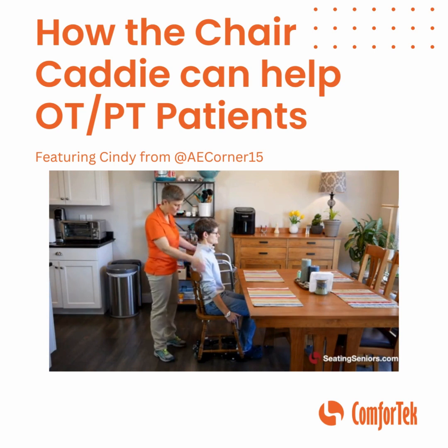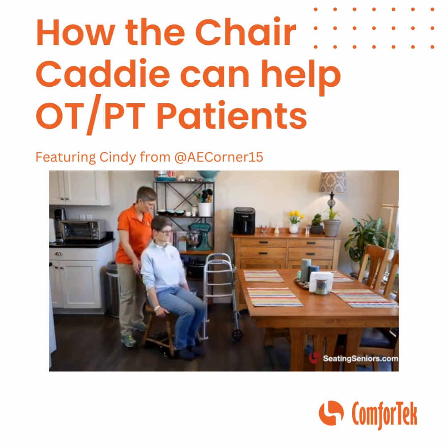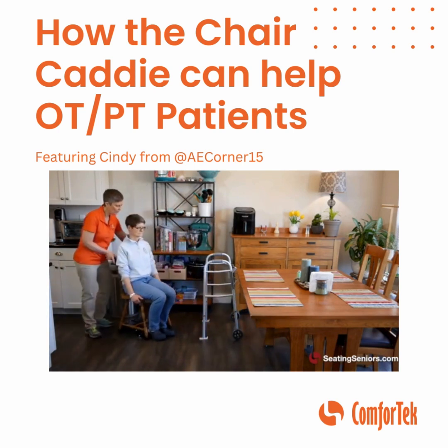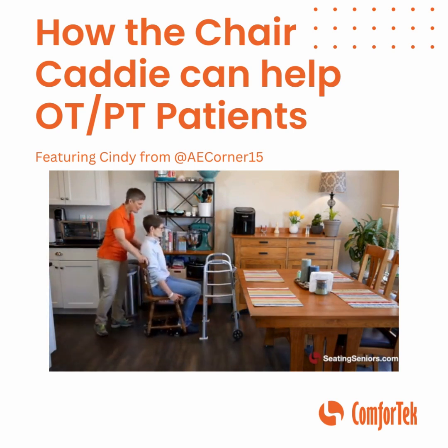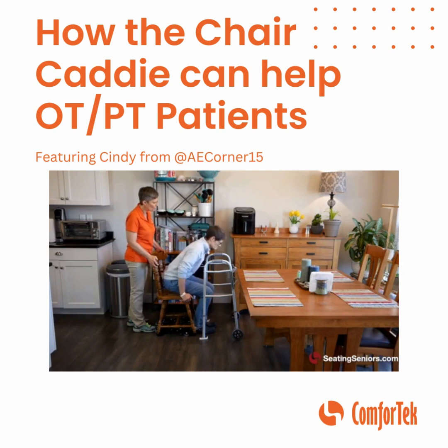Now once she's done, again, no pushing or pulling of the chair. You're going to release the brake. You're going to bring the Chair Caddie right back over here with her to her walker. Get her lined up there. You apply the brakes again. And then, Christina, you can go ahead and stand back up to your walker.